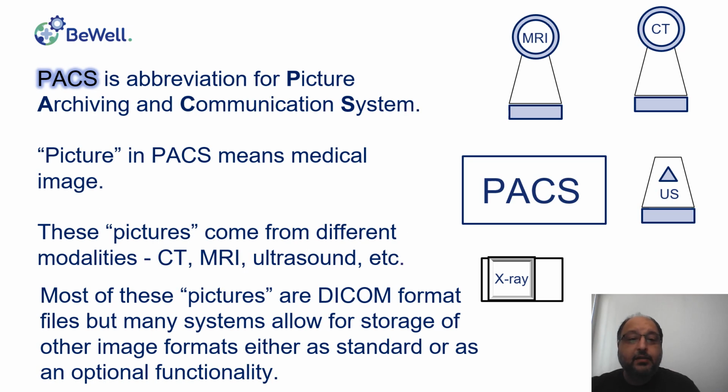First, PACS is an abbreviation for Picture Archiving and Communication Systems, and as you may consider, the picture in PACS means medical image, not some object of art, and these pictures come from different modalities, for example, CT or MRI or ultrasound or X-ray and so on. Most of these pictures are DICOM format files, but many systems allow for other image formats to be stored either as a standard option or as an optional one.